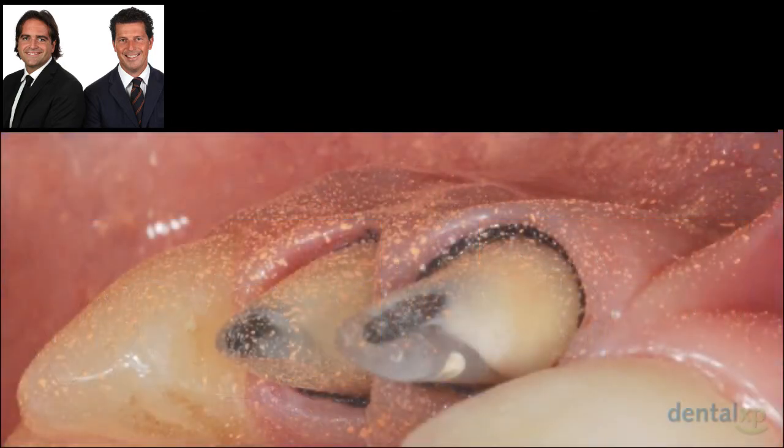Same thing for the digital part. You can see here in this picture very little powder, as I was saying, only to give the possibility to the scanner to be a little bit faster.